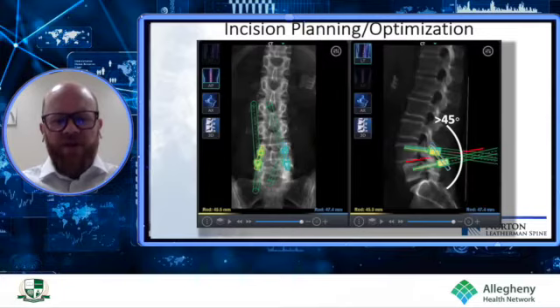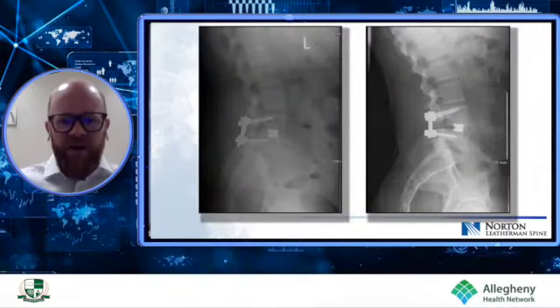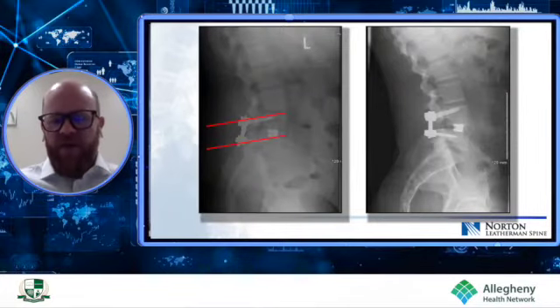Here's also an example of what we modified. This is my construct on the left. Both are up and out, right? You see how those screws don't intersect on the skin, to allow me to optimize my incision. Image on the right, this is what I've modified it to. Now we can go through that facet joint. You're fusing that facet joint, right? You can violate it. It's no big deal.